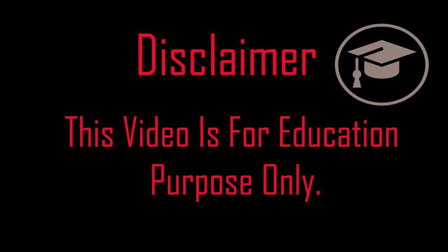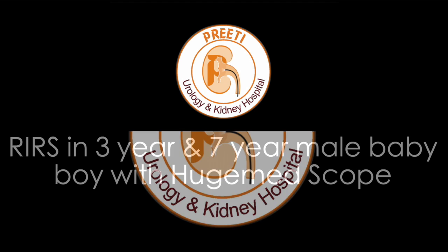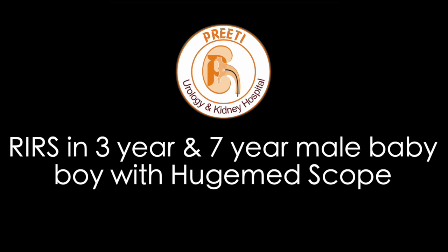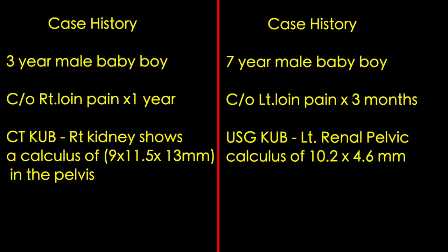This is a case presentation of two pediatric RIRS procedures done with one of the smallest flexible digital scopes available, which goes through the 9.5 by 11.5 access sheath. No conflicts of interest for the demonstration. The two patients are a three-year-old and a seven-year-old male, and we are comparing not only scope performance but also stone volume versus operative time with thulium fiber laser.